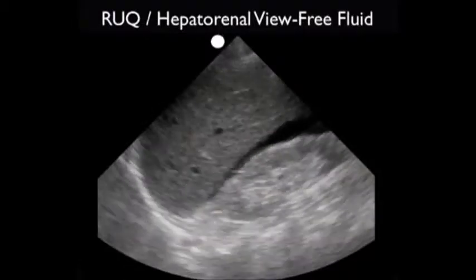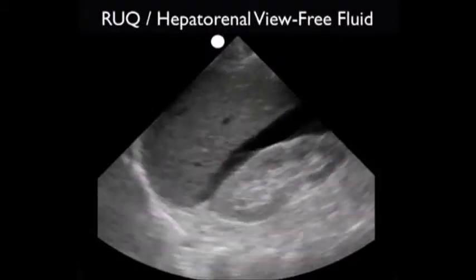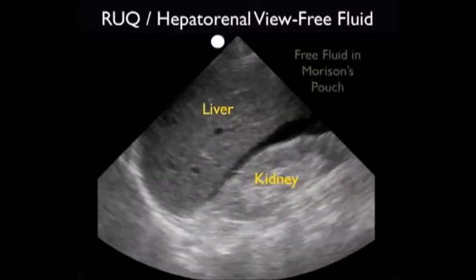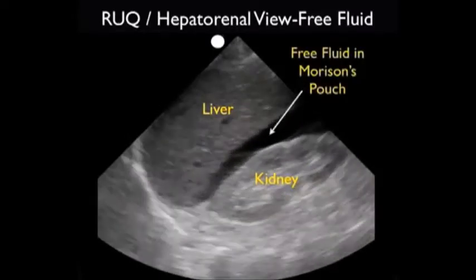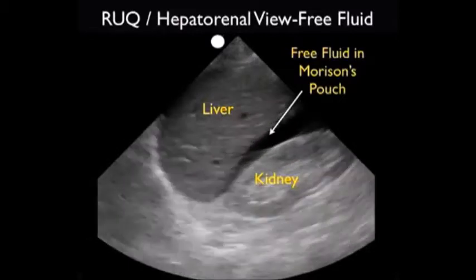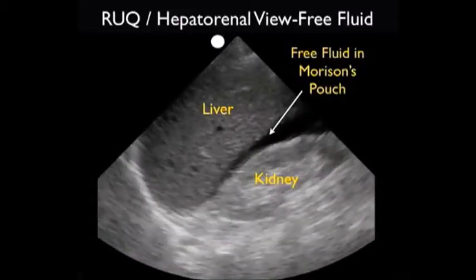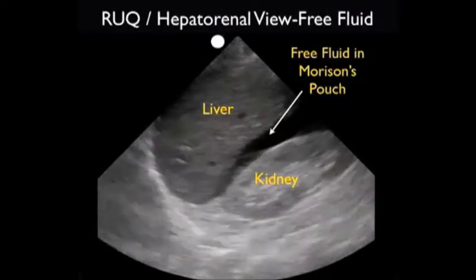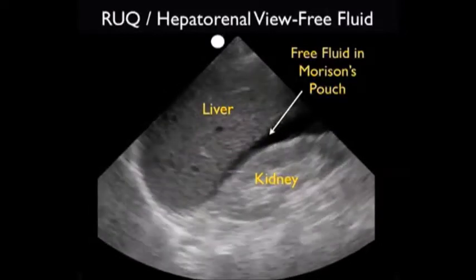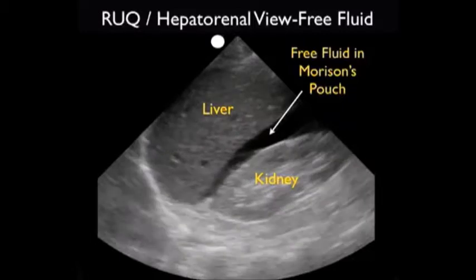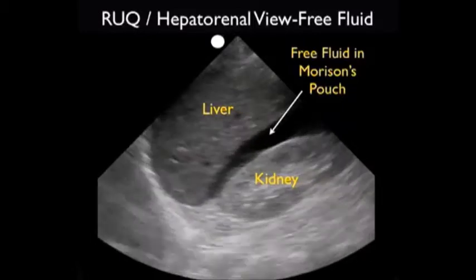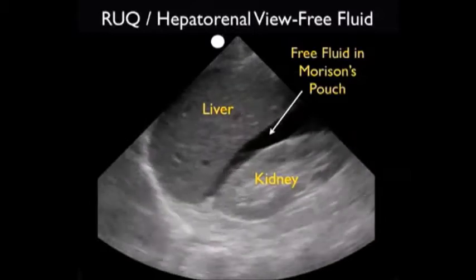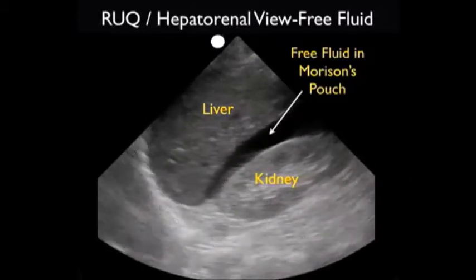Here's a positive ultrasound examination from a patient who was hit by a car while crossing the street. We see the liver in the middle of the image, the kidney located inferior and posterior to the liver, and in between them in that potential space known as Morrison's pouch, we see a dark or anechoic fluid collection — actually a pretty large stripe in this patient. This represents the positive examination, the presence of fresh fluid, in this case blood, within Morrison's pouch.